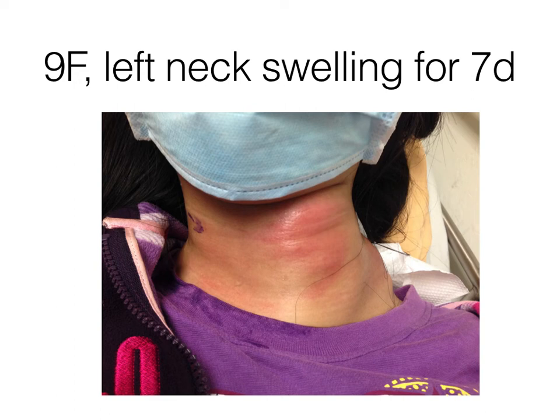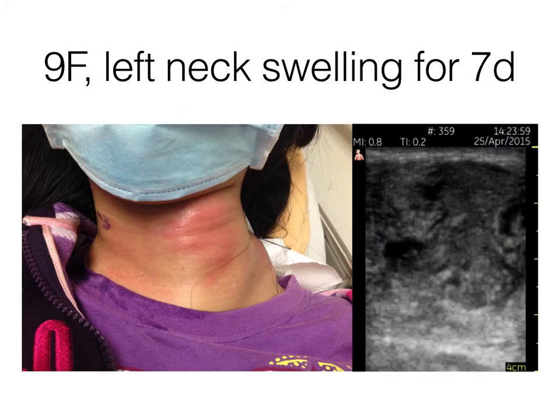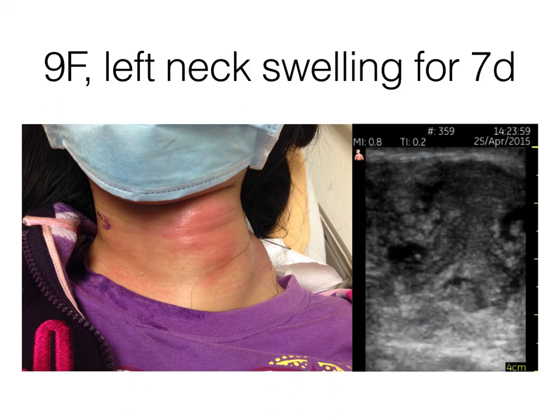The mark means the girl's cricothyroid membrane. So deviated to the right side, obviously, right? If the patient develops dyspnea, an airway problem, it is definitely a difficult airway instead of the traditional one. So let's see how ultrasound can help us find the problem. Transversely, the liquid, right?